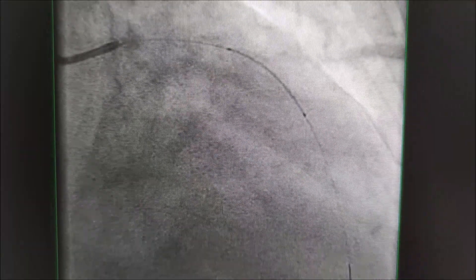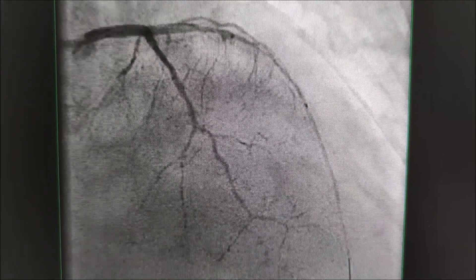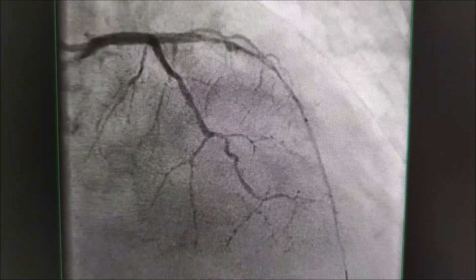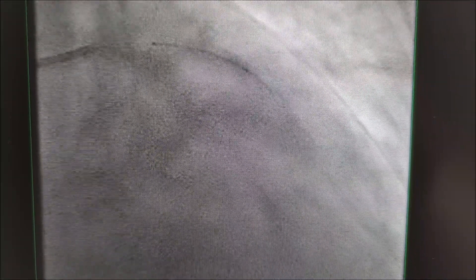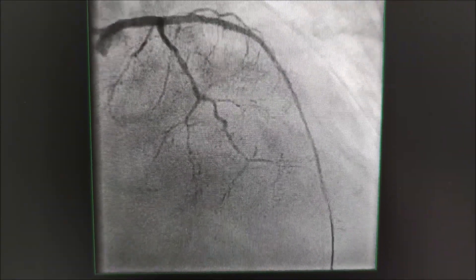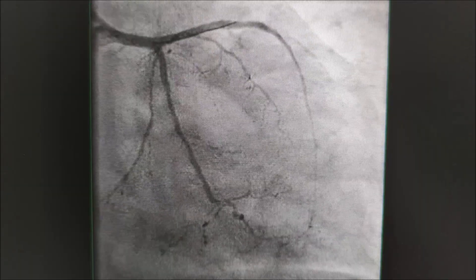Therefore we performed PCI of the medial part of the LAD with one long stent. After that we implanted another stent with some overlap to the proximal part. Finally, we optimized the proximal part of the stent with a non-compliant balloon. This is the final result.